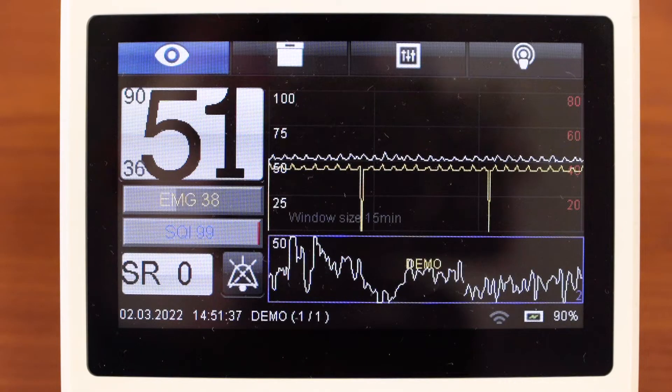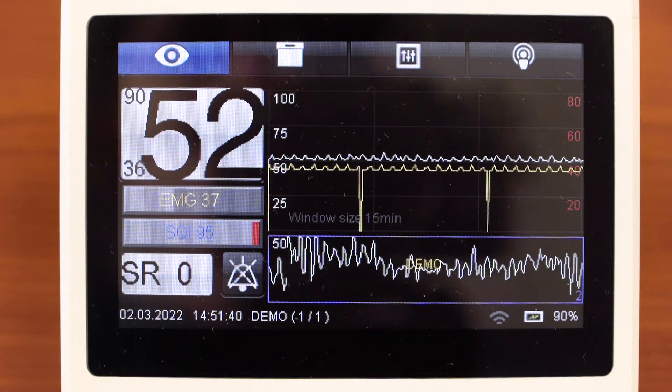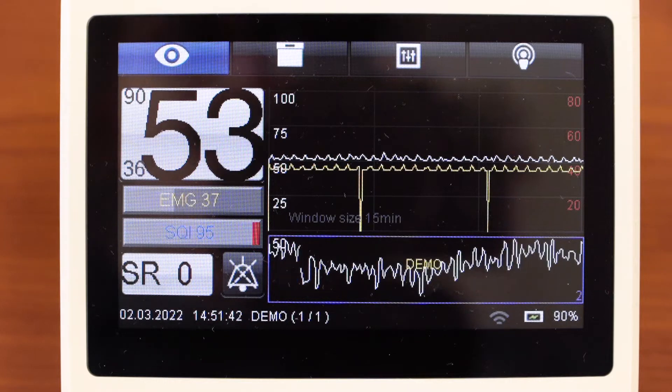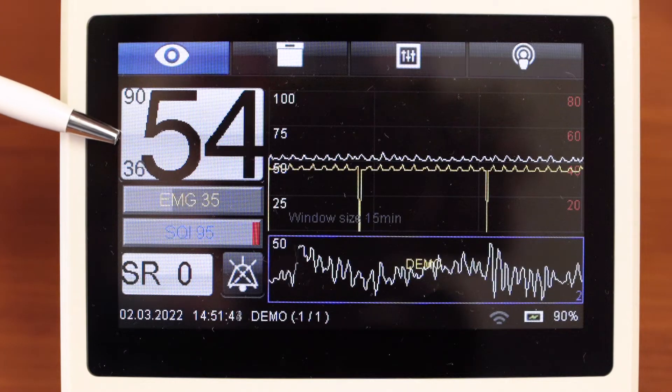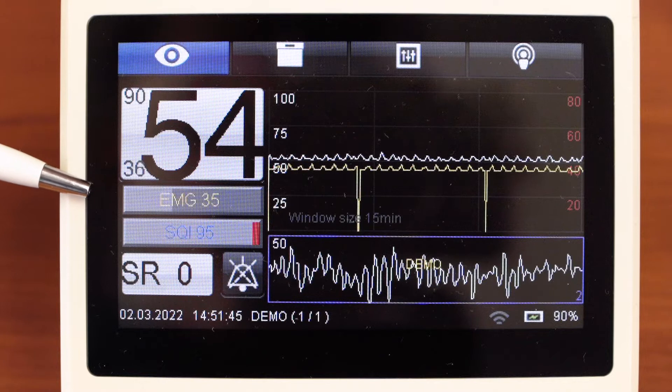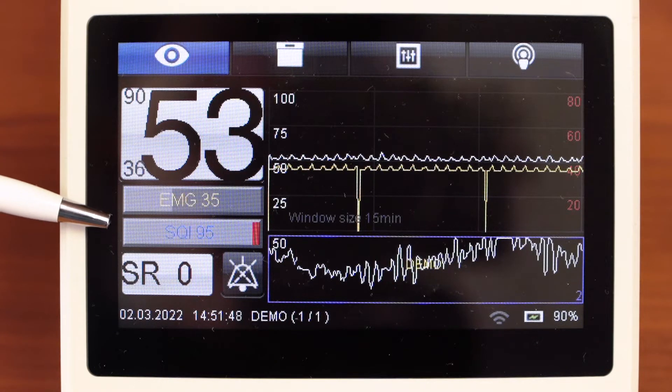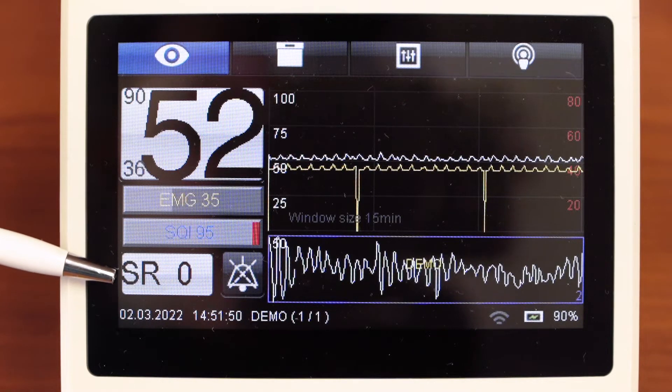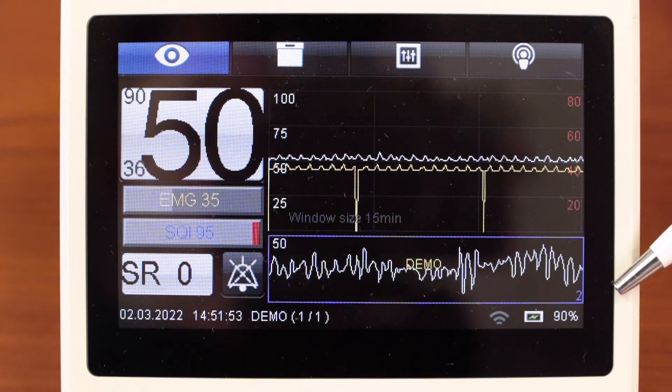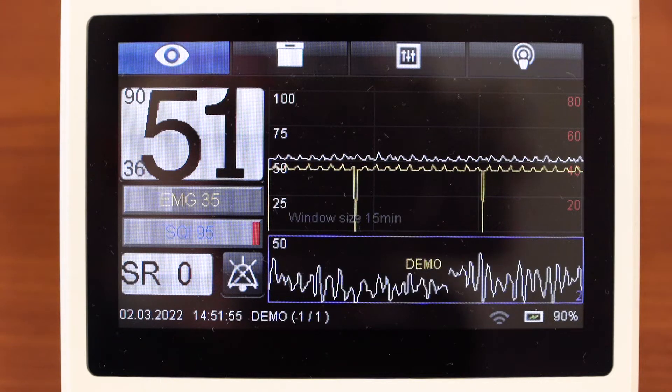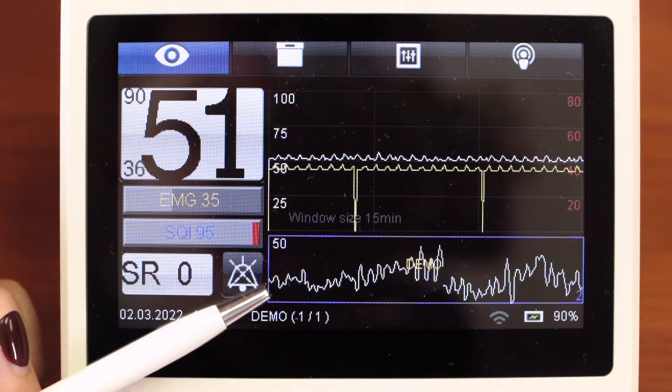There are 4 windows on the display. The first window is monitoring. We can see the main parameters: brain activity index, electromyography component, signal quality index, and suppression rate. Also we can see RAW EEG signal or EEG spectrum, and alarm silence button.